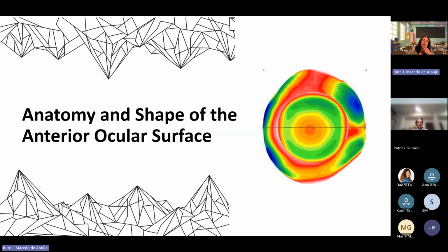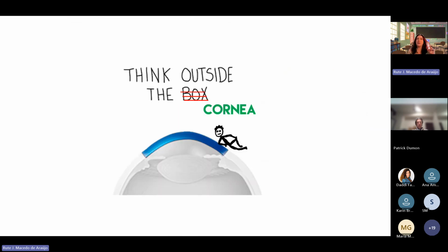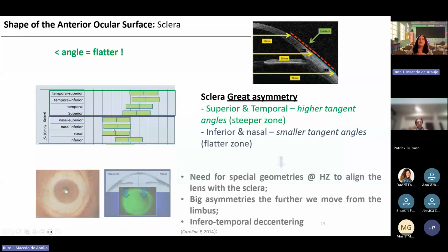And of course, because scleral lenses land on the sclera, we need to know the shape of the sclera. So we need to think in this case not outside the box, but beyond the cornea. I will show the results of some studies that measured the asymmetries, and we can see that near the limbus, the values of the tangent angles, so in the limbal area, are very similar across the different meridians. But when we move away from the limbus, we start to see very big asymmetries. We can see that the inferior and nasal areas have smaller tangent angles. That means that these areas are flatter, and this will have some implications.